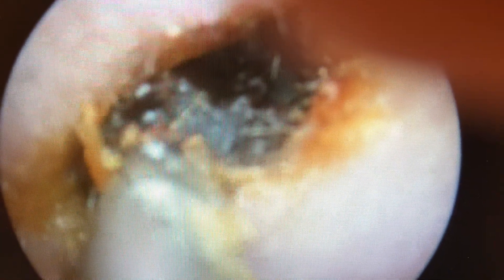This video is shot in real time; approximately 1 minute was required to remove the wax. Periodically the suction becomes clogged due to the thickness of the wax.